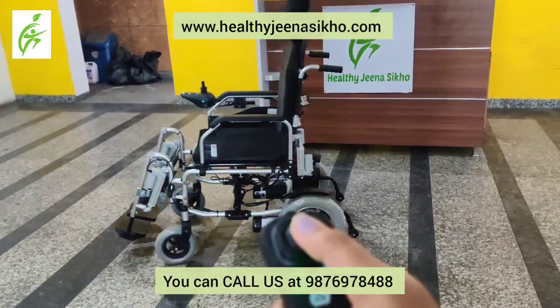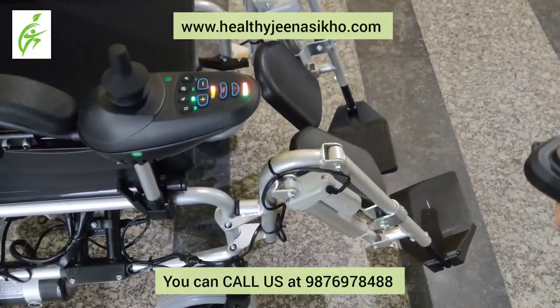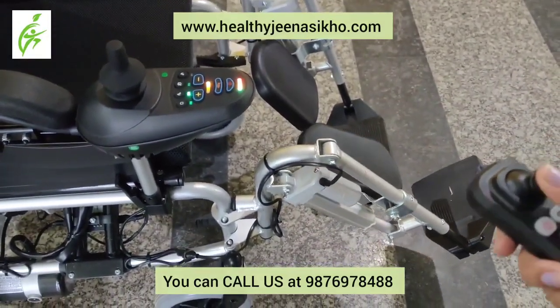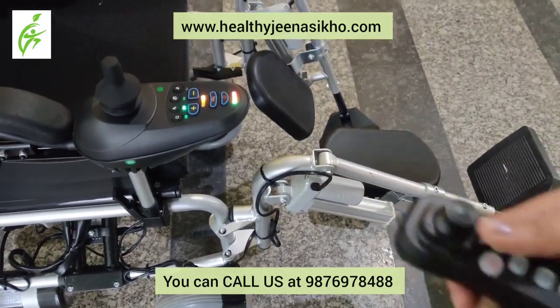You can recline the wheelchair and adjust the footrest. You can stop the footrest and set the wheelchair very comfortably.